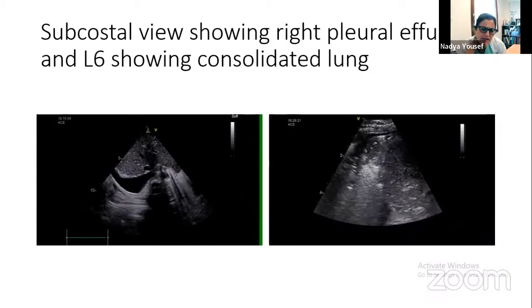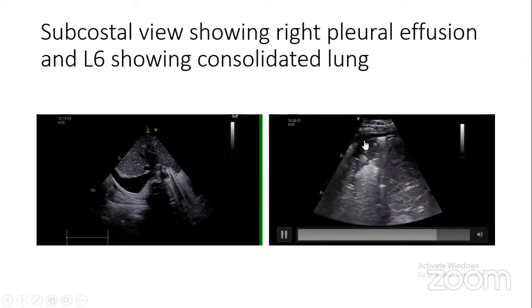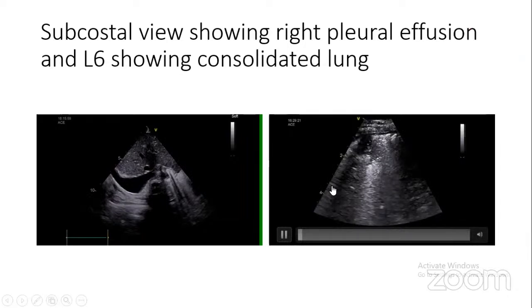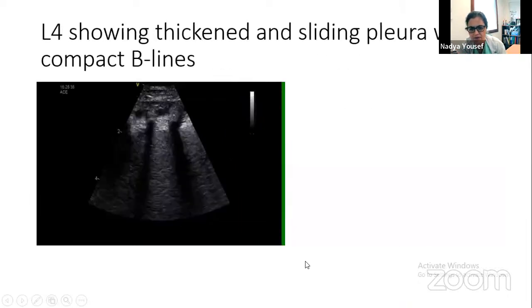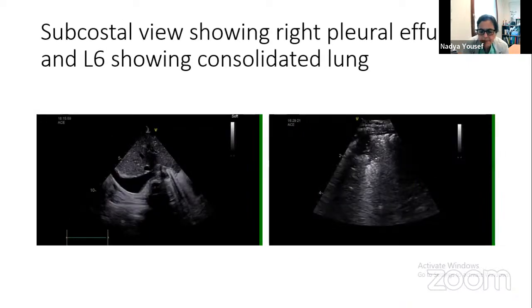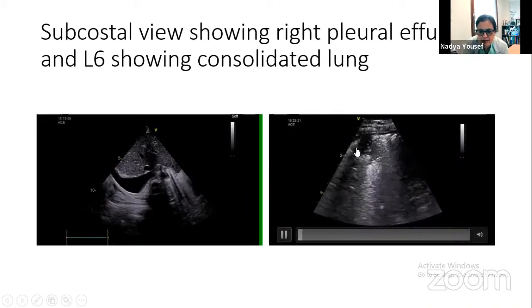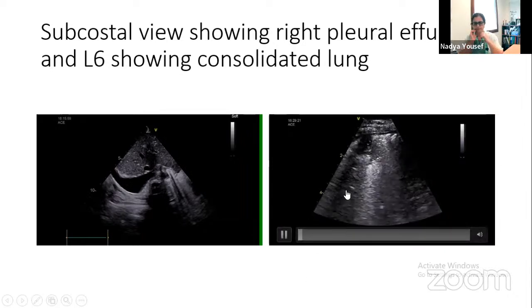It's interesting how the CRP levels were not at all raised. You mean this area? Yeah, you are right. This, and also if you go downwards on the clip, a little further down on the other side. You mean this side? Yeah, further up. Oh yeah, over here, if you turn the clip, you'll see it goes deep down as a kind of shred sign. But it depends on how the baby's breathing. We can see it on and off. Let me play it again. Yeah, you can see here. It goes down every time, but further, deeper down. So probably yes. Oh, thank you.